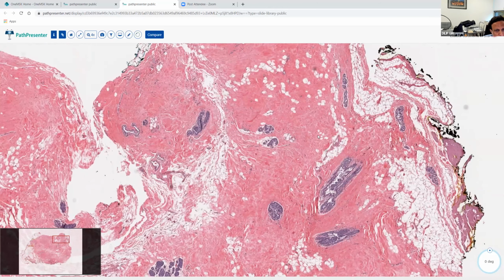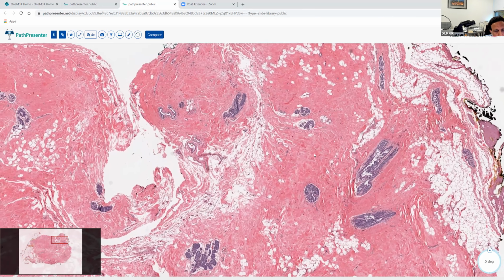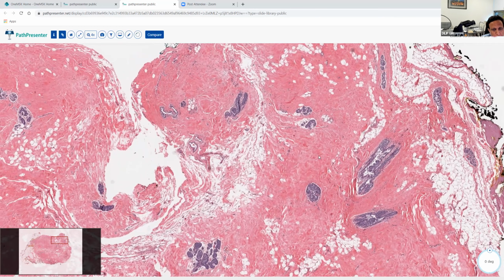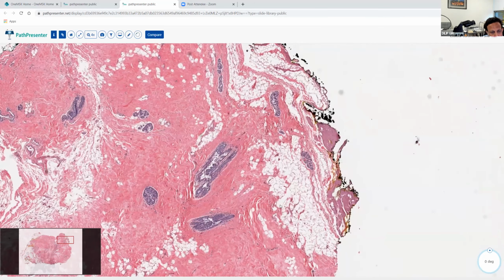If you see a lot of LCIS in a core biopsy, and certainly if you see an unusual type of LCIS, the florid or the pleomorphic LCIS, please look at all the cores and also the fat in the biopsy very carefully, because whenever you have extensive LCIS or the unusual types of LCIS, that is when there is a possibility of associated invasion.